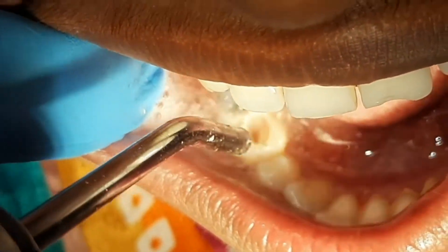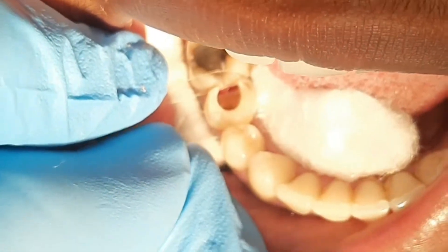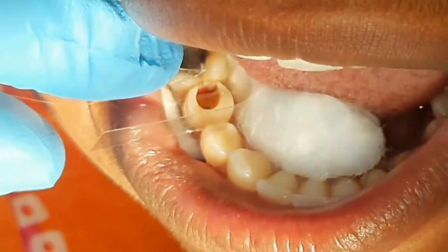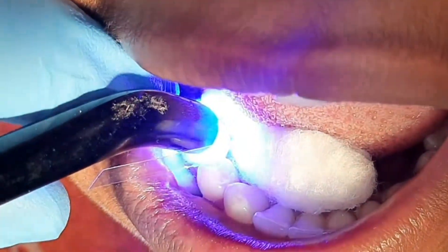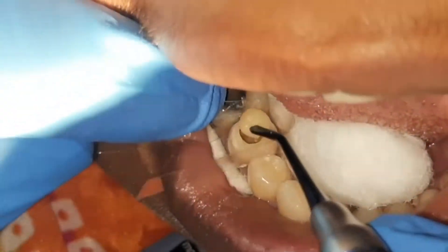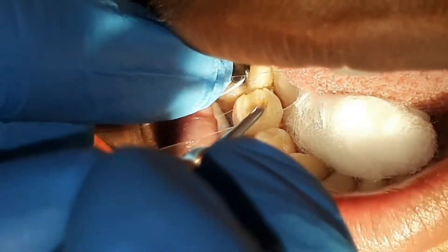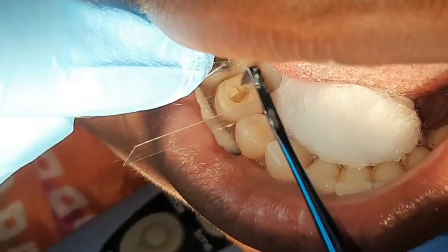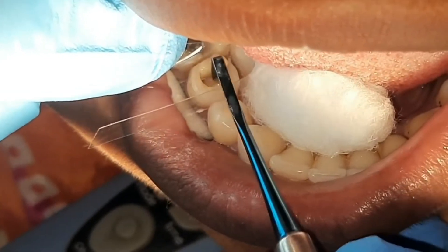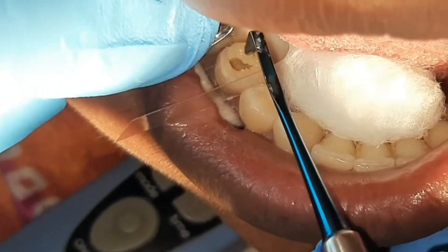Wash it and dry it, then apply universal bond. Here I am using composite material to restore the shape and function of this damaged tooth. The cavity is always filled layer by layer — first a white bulk filling.